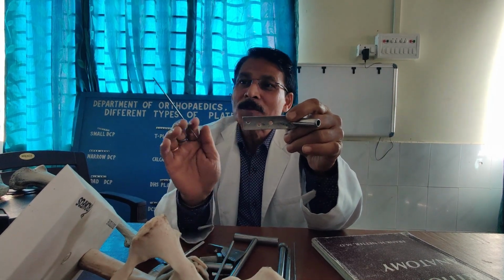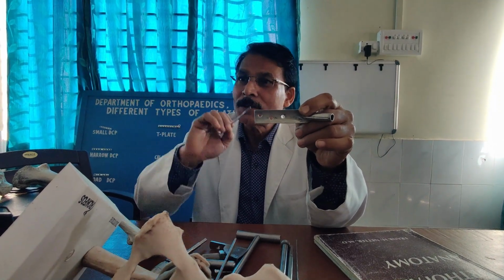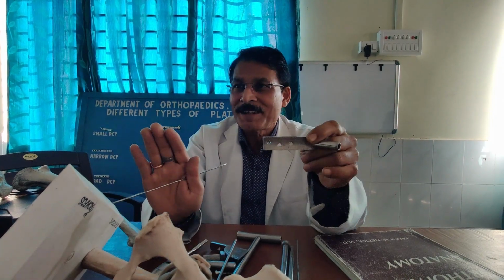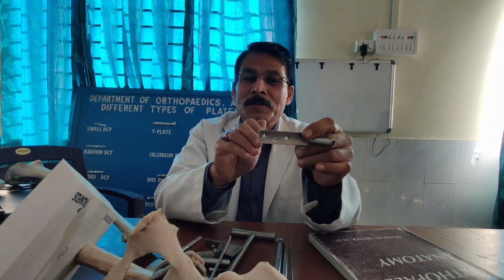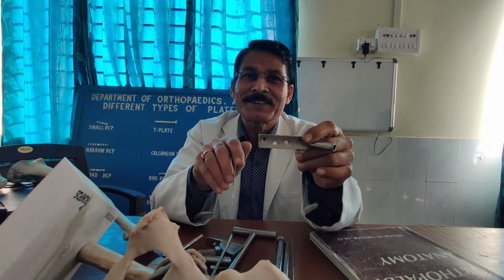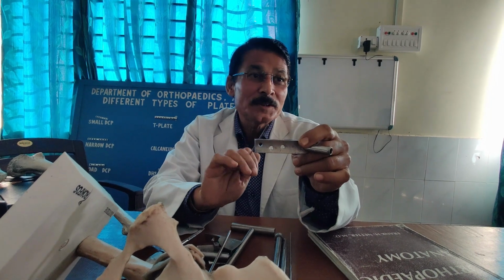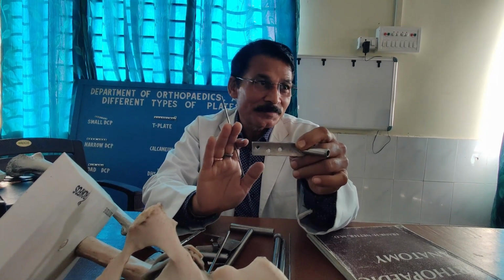Same is true for the DCP also. You look at the DCP, the holes are not in the same line. They are coming like this. So this is going to help you in the sense that they are not on the same line, so the stress riser is not here. This is going posteriorly, this is going anteriorly, this is going posteriorly. That will gain better purchase and reduce the failure rate.